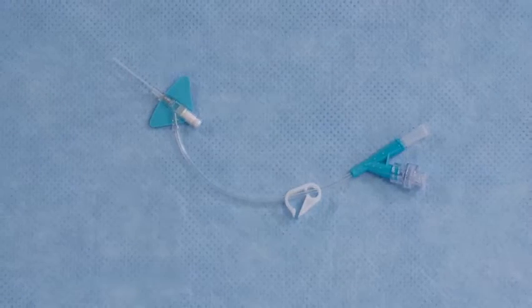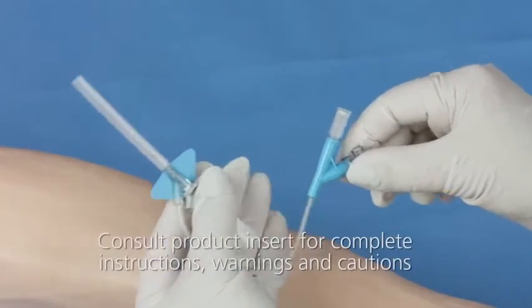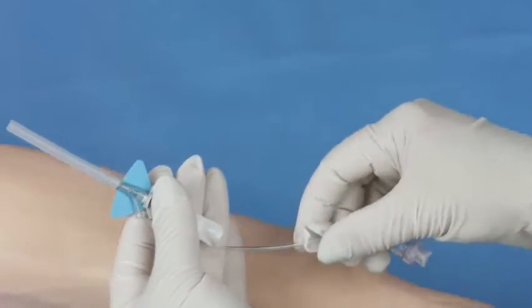Here's how to insert it. After removing the catheter system from the package, ensure the vent plug and needle-free connector are secure and the clamp is not engaged.